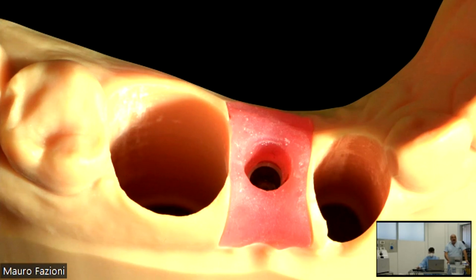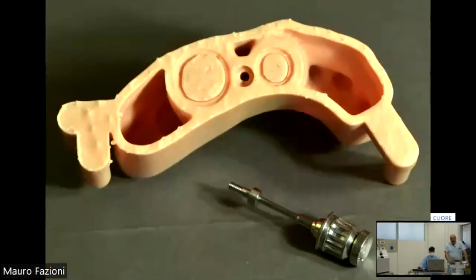So second surgery needs another healing of the gum into the emergence profile of the provisional prosthesis. It's very important for us to record the final shape until the early healing abutment, okay?